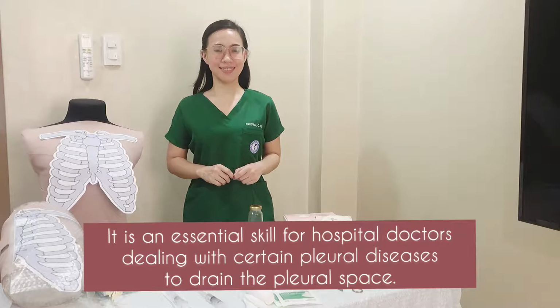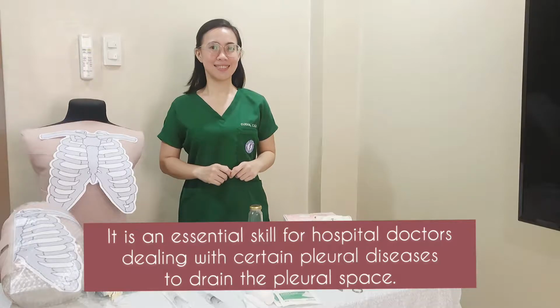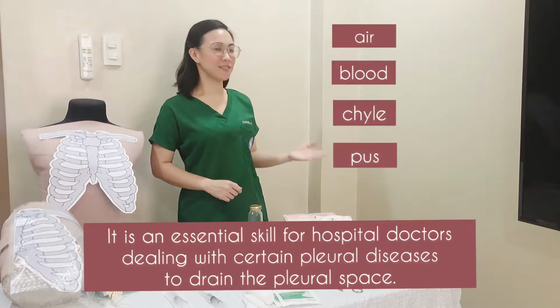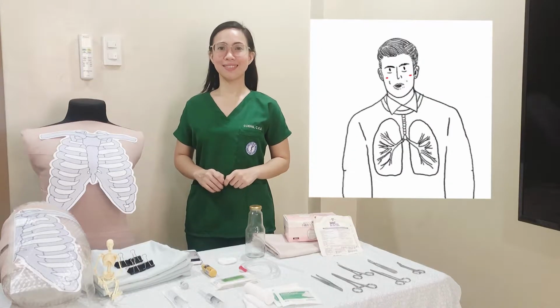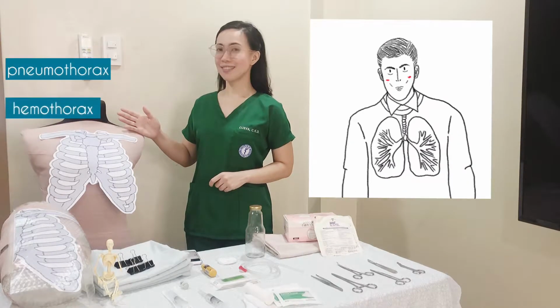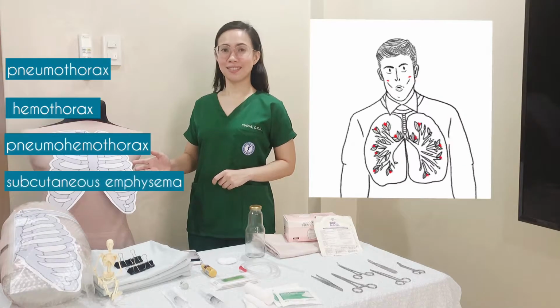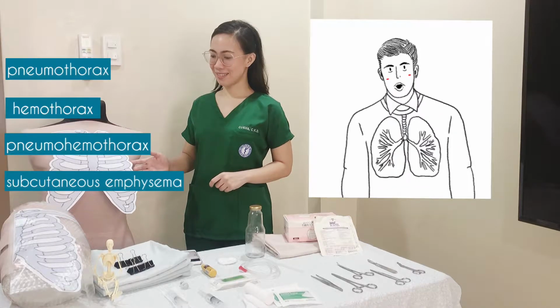Chest tube insertion is an essential skill for hospital doctors dealing with certain pleural diseases to drain the pleural space of air, blood, chyle, pus, and any other fluid. Chest tube insertion is indicated for patients having pneumothorax, hemothorax, pneumohemothorax, subcutaneous emphysema in patients who sustained chest wall trauma, and empyema.